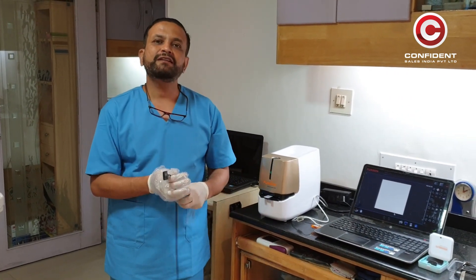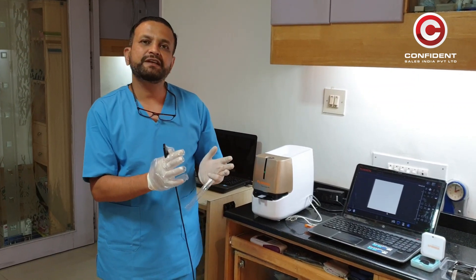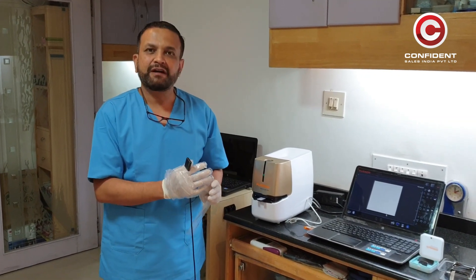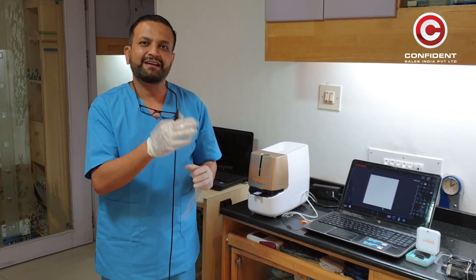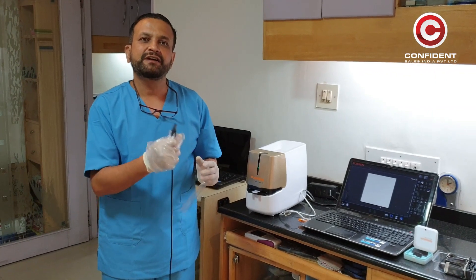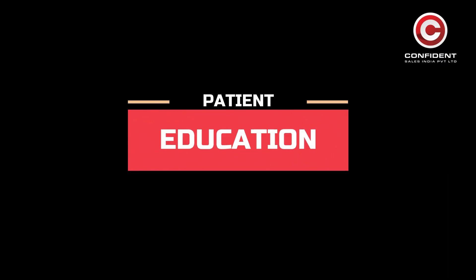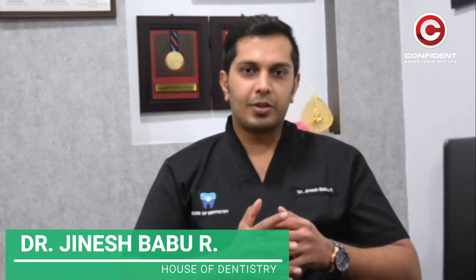For me, the system of PSP looks much more professional and I feel that it is much more insulated from cross-contamination. When I compare it with regular RVG devices, I am going to show you about the X-ray scanner which we use at our practice.